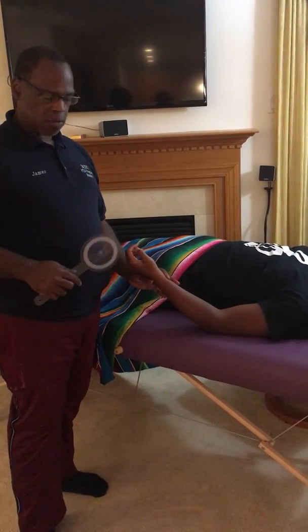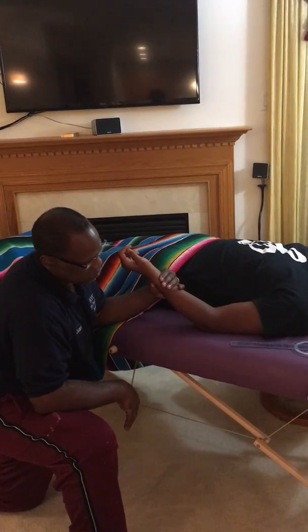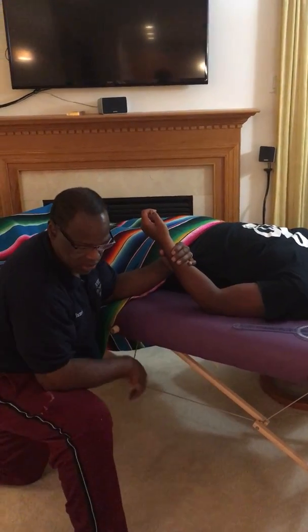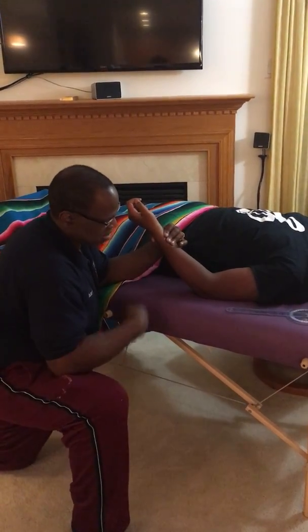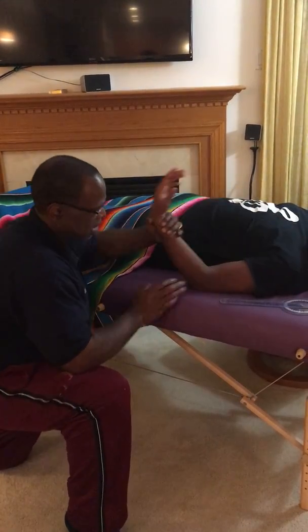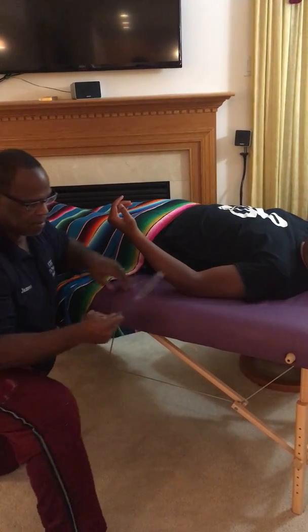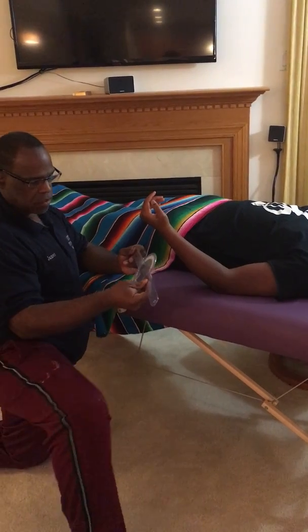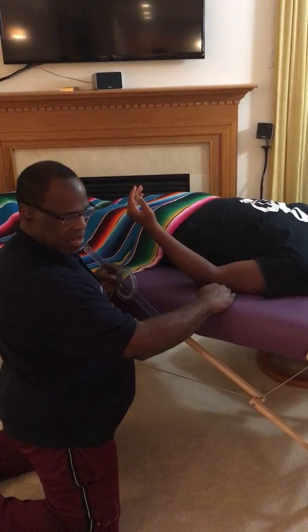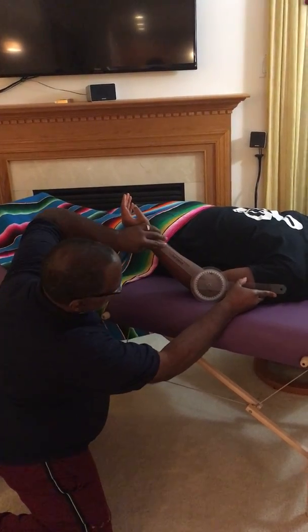If we're measuring elbow flexion, the starting position could not be 0, because we have not made it to that point because of, let's say, tightness of the bicep or something in that joint capsule. All right, so the starting position would be whatever this number would be here to that number. All right, so let's just see. We're going to say that the person can only extend their elbow to this point. All right, and we're just going to look at flexion first. We're talking about negative measurements, but let's talk about flexion first. And again, we want something under this distal elbow so that we can see. All right. So I'm going to go ahead and measure.